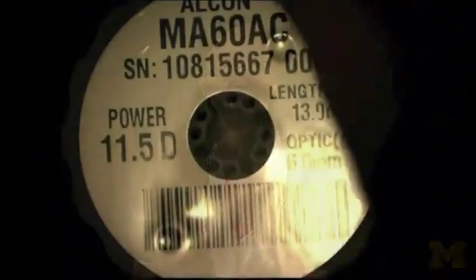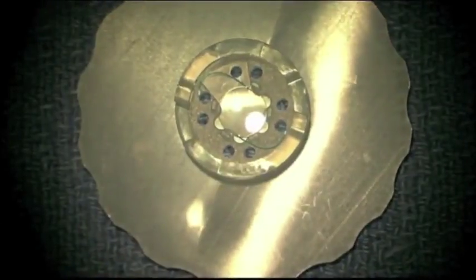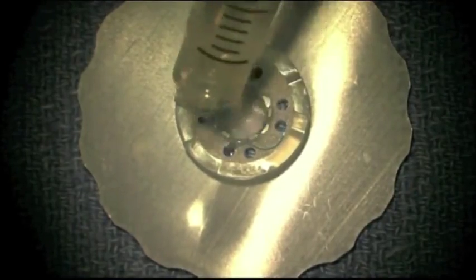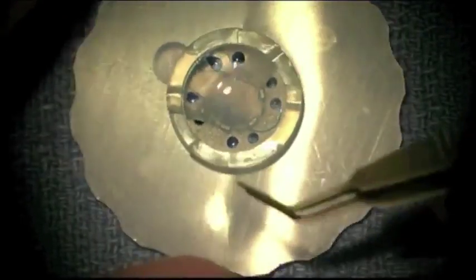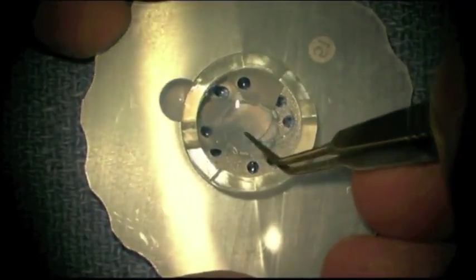This video demonstrates how to fold a three-piece intraocular lens in preparation for injecting it into the eye. We're using an MA60AC lens and the power is 11.5 diopters. You can drop a few drops of BSS onto the surface. Then using IOL forceps, you can grasp the intraocular lens at the optic-haptic junction.